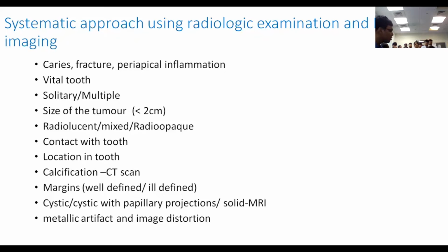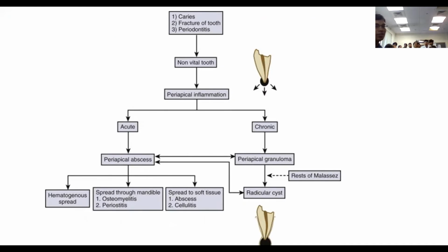So if you want to image a patient who already has dental fillings and it is difficult to give an interpretation on CT, you do a supplemental radiograph, and if it is not giving any clue, then you can go ahead with an MRI. Okay, so these are the things. These are the three things you have to remember.